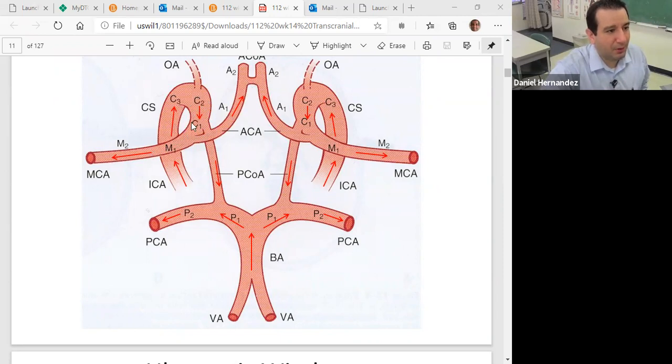We try and find this landmark, which is designated by this bidirectional flow, where we have the middle cerebral artery flow coming towards us and the anterior cerebral artery flow going away from us. As we get down a little bit further, you'll notice we'll see a hypoechoic butterfly in this area, and you'll be able to recognize that. So our vertebral arteries, we're coming from our suboccipital window, and blood flow is going to be away from us in both the vertebral and the basilar arteries.